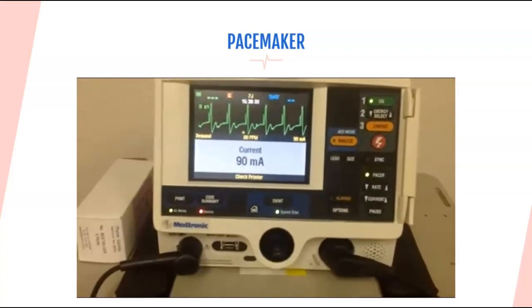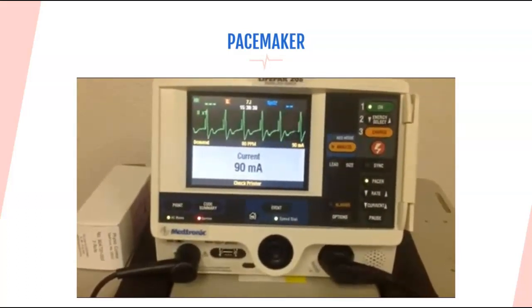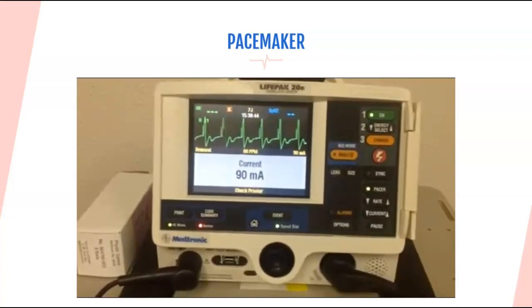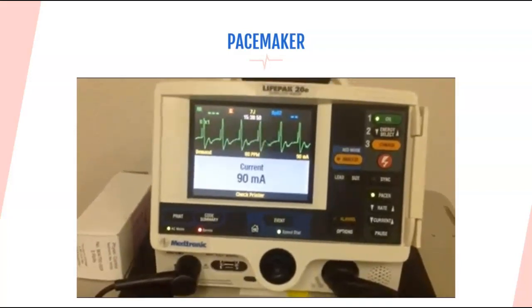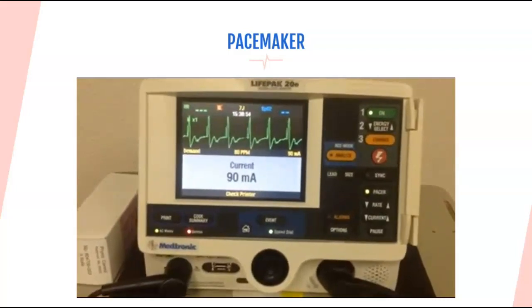Now, this is a transcutaneous pacing. It is a temporary thing, and you would want to take your patient to the cath lab to have a transvenous pacer placed. So here again, your cardiologist would be in charge of that. But you've got the patient stabilized at this point. You'd want to check their blood pressure and prepare them for transport.